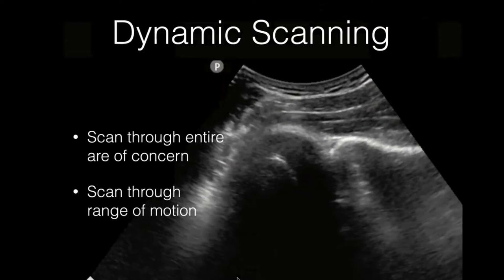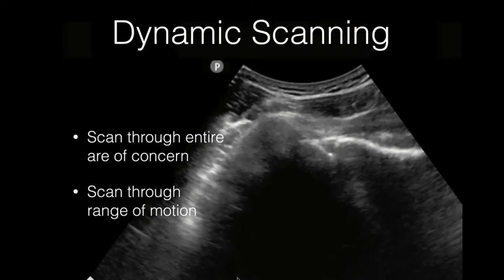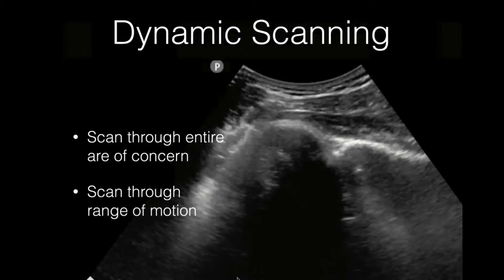The other benefit is dynamic scanning — scan through the area of concern and then scan through the whole range of motion. This is a shoulder being internally and externally rotated; you can see how that joint articulates and the musculature involved.